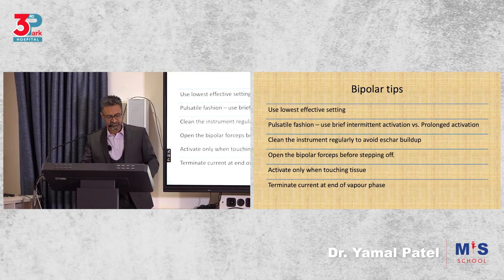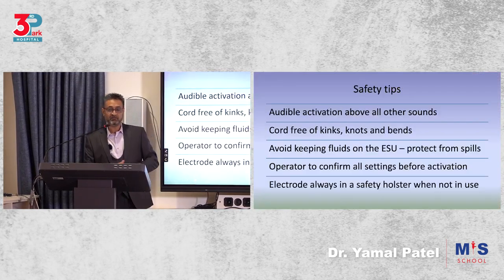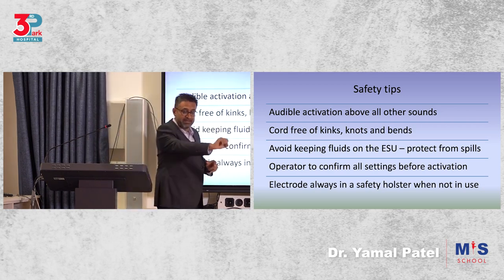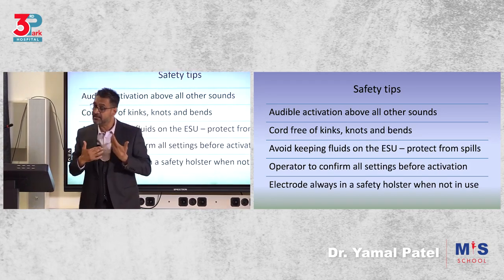Activate only when touching tissue. Terminate at the end of the vapor phase. Keep the volume of this equipment loud, so it should be audible, probably above everything else in the theater.